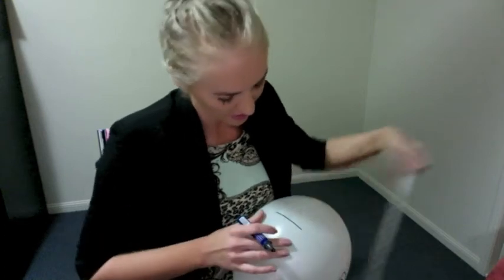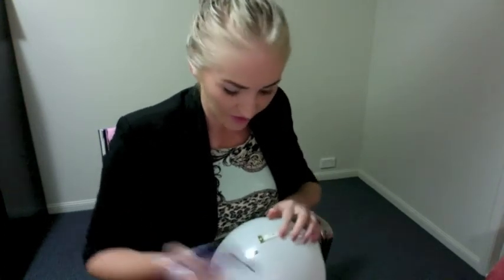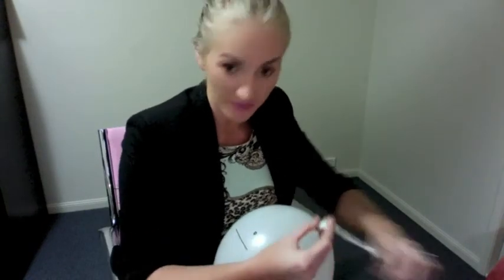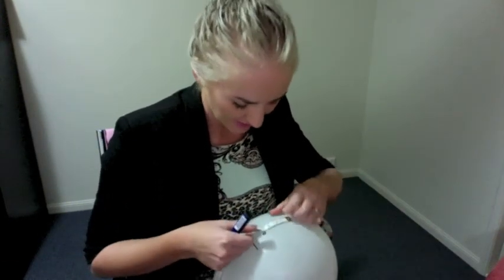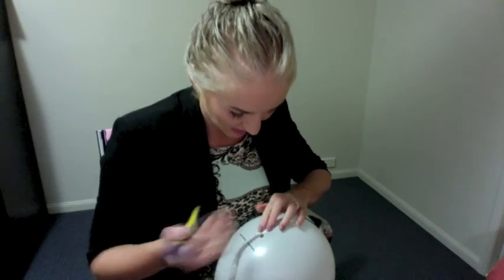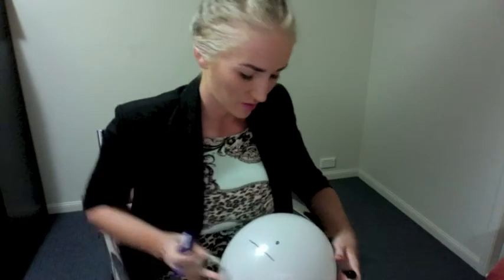Now that we have the frontopolar position, we will do the exact same thing. Turn the patient's head around and measure 10%. We will now mark above the O and the frontopolar positions. We will go 20%. So 10% was 3, so 20% is 6. So we'll go 6 centimetres above these points just here and mark the patient's scalp again.